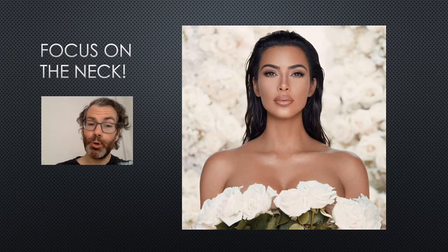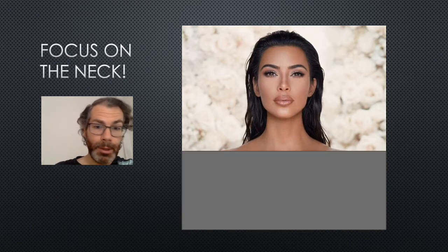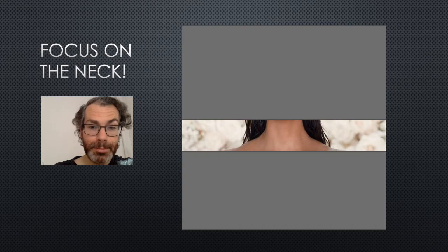But the part of the gallbladder that we want to focus on is the neck. So if a gallstone is sitting in the body or the fundus, then it's not causing any problem, it's just incidental. It's when it gets impacted in the neck that it actually causes a problem. So we really need to focus our exam on the neck of the gallbladder. Don't get distracted by the body, just focus in on the neck.